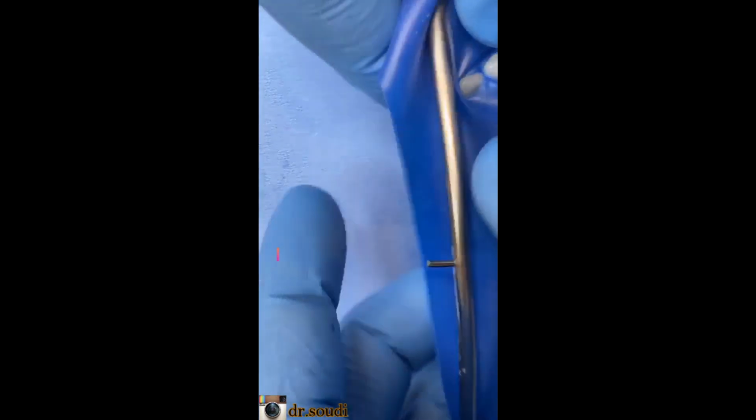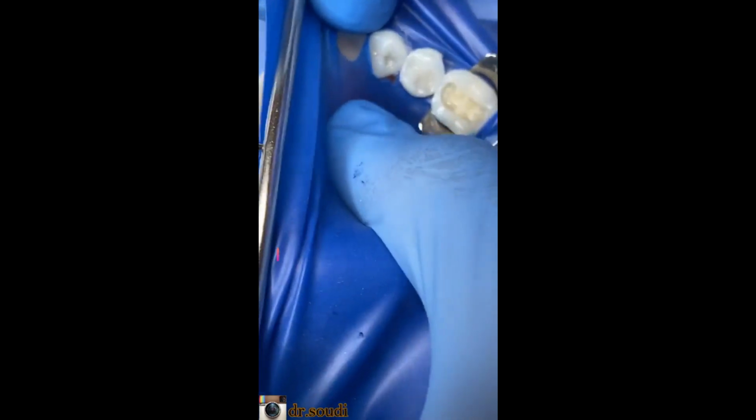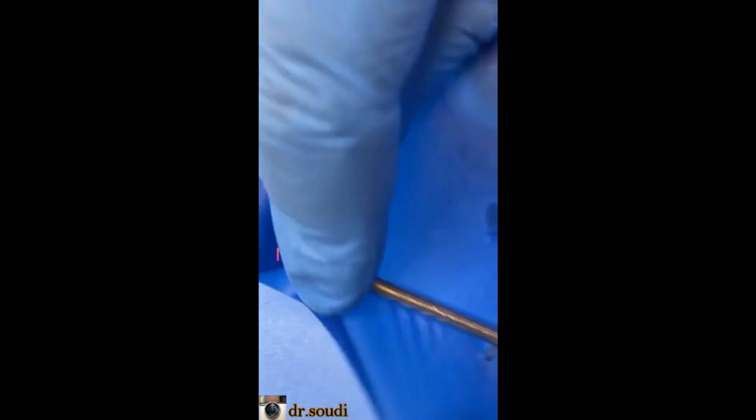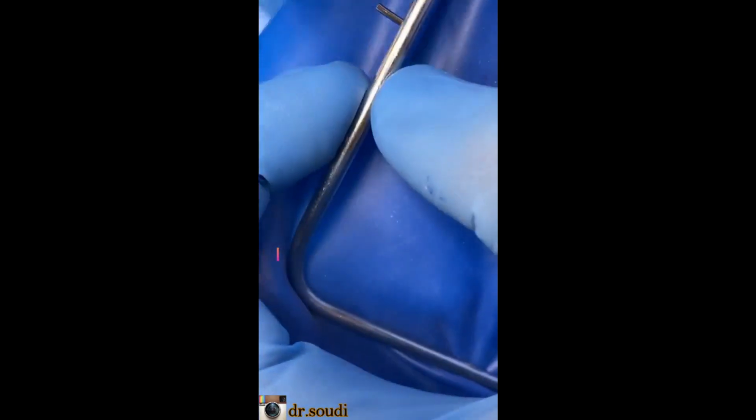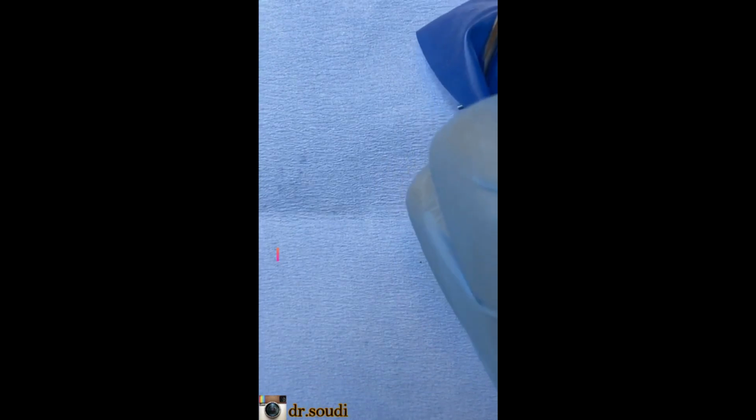The question here, to use a waxed dental floss or non-waxed one. I prefer to use the waxed one because it will not tear. Okay, still have this canine. I told you need an assistant. I usually do this, but this costs. It's a cost.